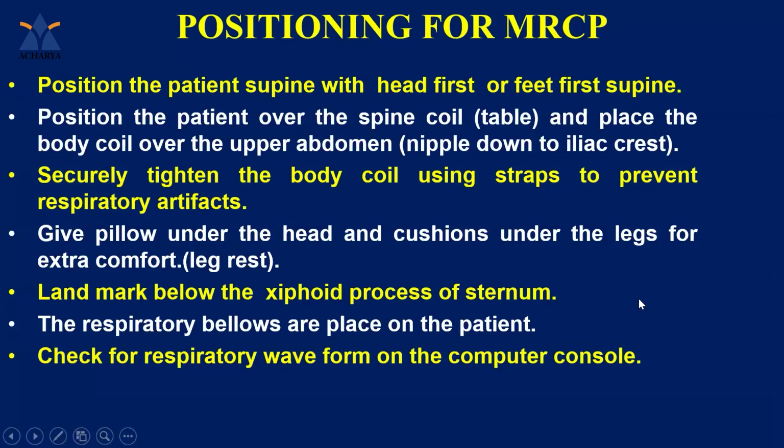The positioning is very, very important. Position the patient supine, head first or feet first, and position the patient over the spine coil, that means the table, and place the body coil over the upper abdomen from the nipple down to the iliac crest.